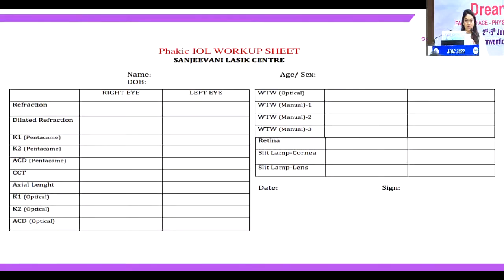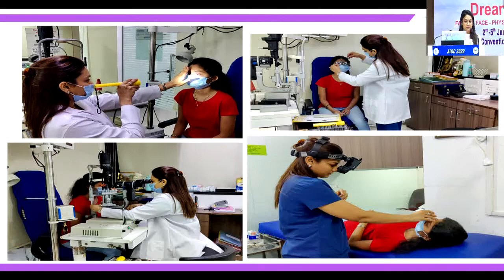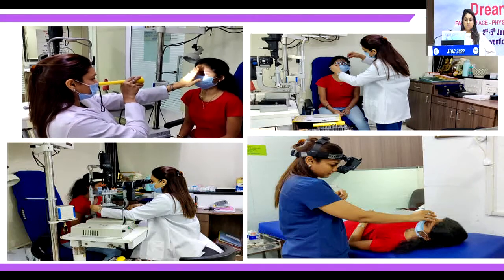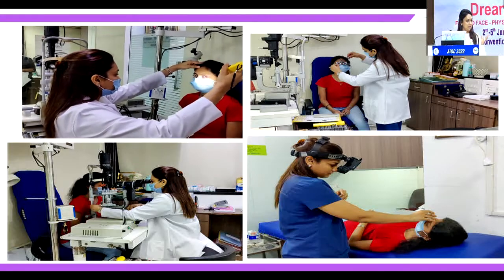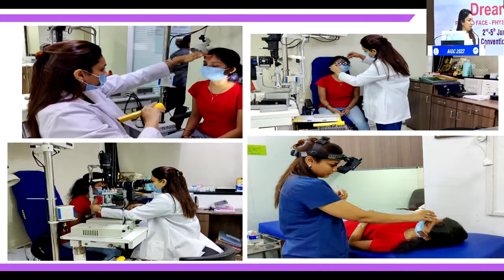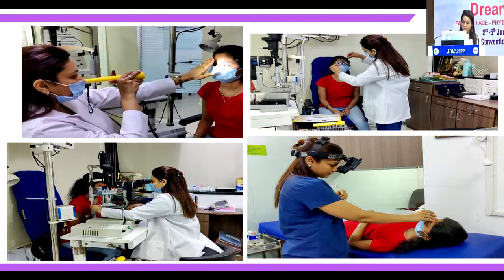So this is my normal protocol, which I'll be discussing very quickly, how I proceed with the phakic IOL in my center. I have made this chart, which helps me not forget even one single point, because it's an extensive workup which you need to do. Going stepwise, the first important thing for any surgery is to rule out any extraocular defects, especially in high myopes. There are possibilities of phorias and tropias. So this is something which we need to see.